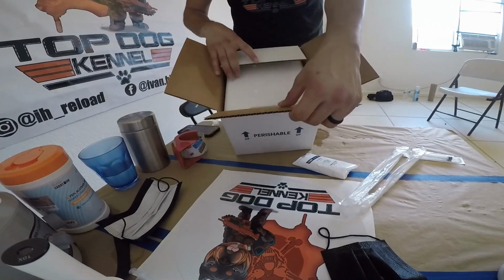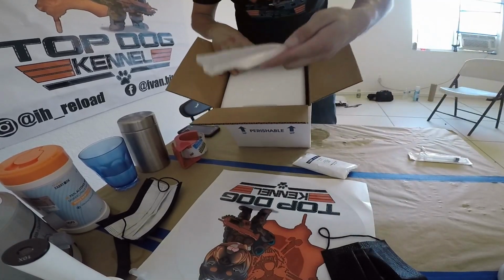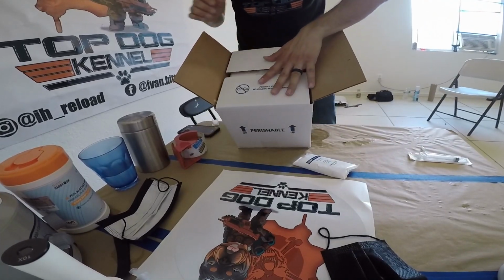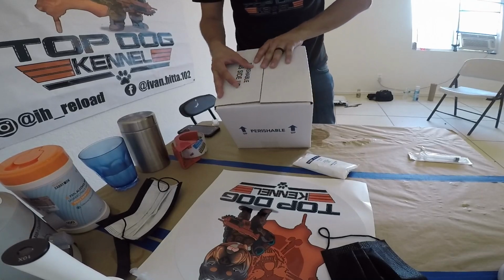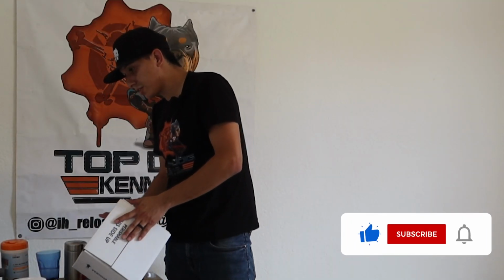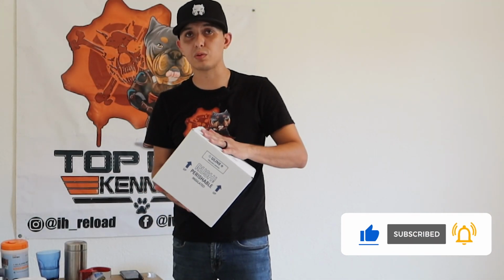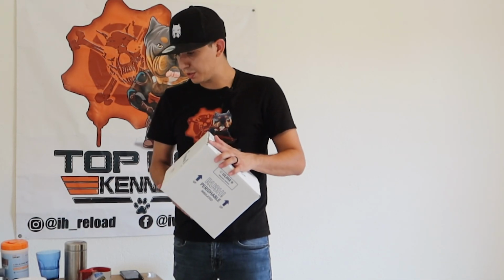Once you're done, if you're gonna include your AI rods, you want to go ahead and include those, close it up, and tape it. After it's like this, you want to go ahead and take it to the UPS store, have it overnighted to your destination, and it'll be there within 24 hours. That's pretty much it, guys.